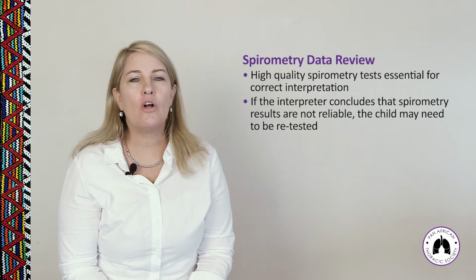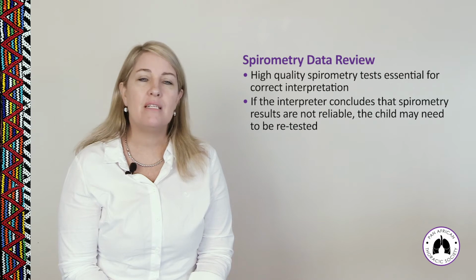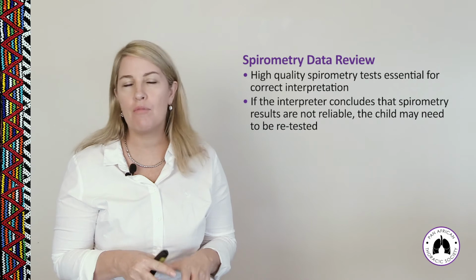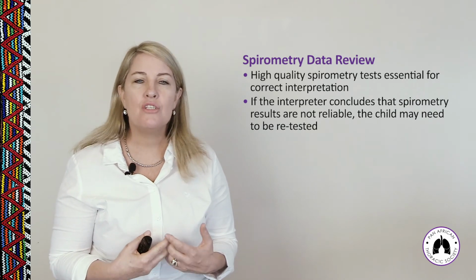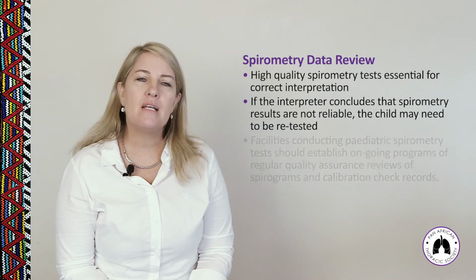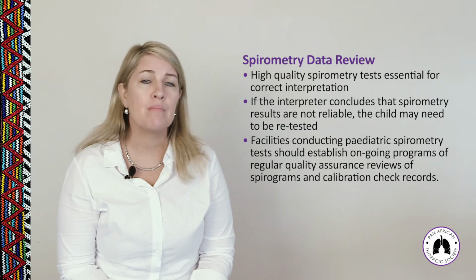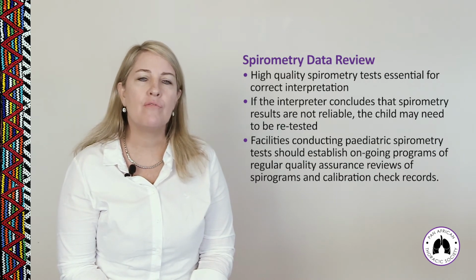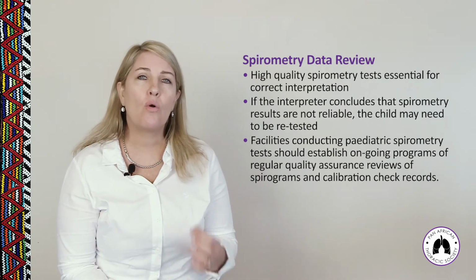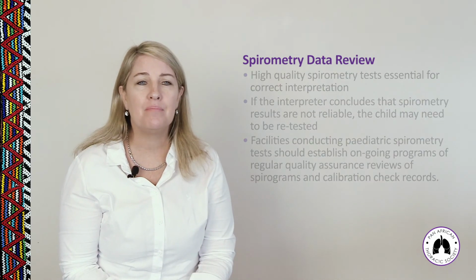So if the interpreter concludes that spirometry results are not reliable, the child may need to be retested, and the effectiveness of the entire child monitoring program could be called into question if there are too many suboptimally conducted tests. So facilities conducting pediatric spirometry tests should establish ongoing programs of regular quality assurance reviews of spirograms and calibration reports to ensure that the overall quality of the testing service is very, very high.